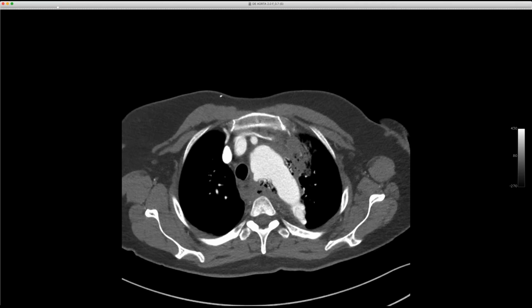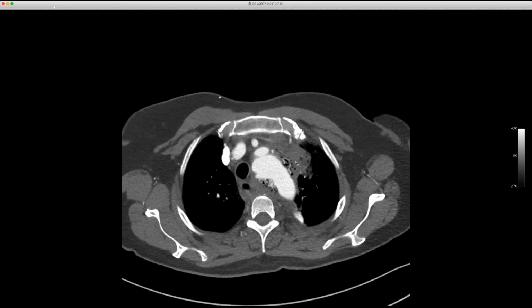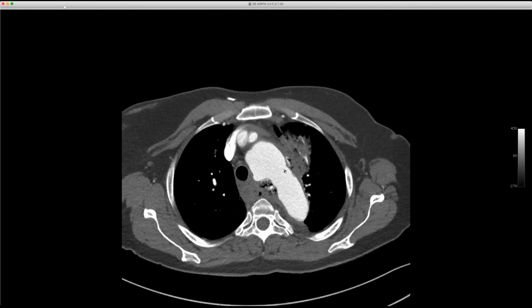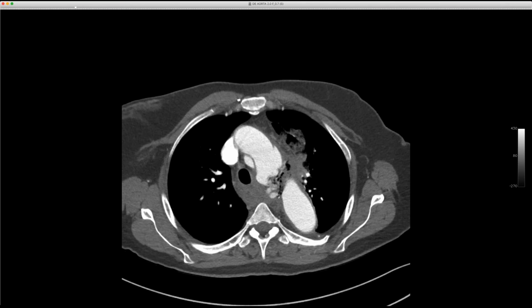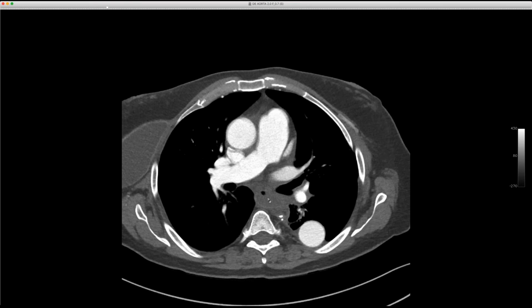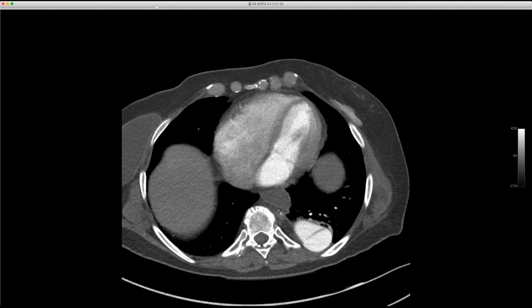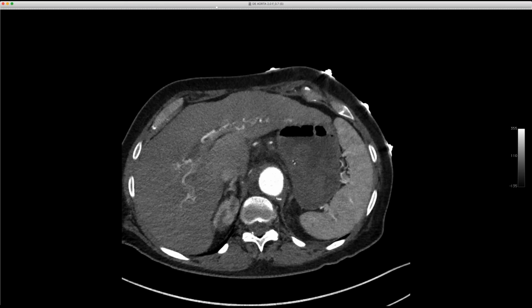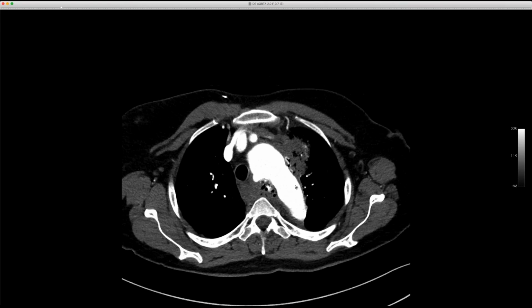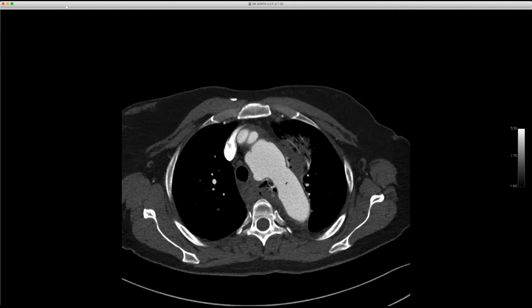And you can see there is gas here in the mediastinum. There's all this soft tissue and fluid. This is the material on the graft here that's wrapped around the repair. And you see all these abnormal contours and all this loose contrast spilling in the mediastinum. There's some atelectatic lung. And you'll follow the esophagus down here. It's full of fluid. It's dense fluid, about 30 Hounsfield units. Goes all the way down to the stomach. And you see this high attenuation material in the stomach. So this is an aortoesophageal fistula related to this infected graft repair here.